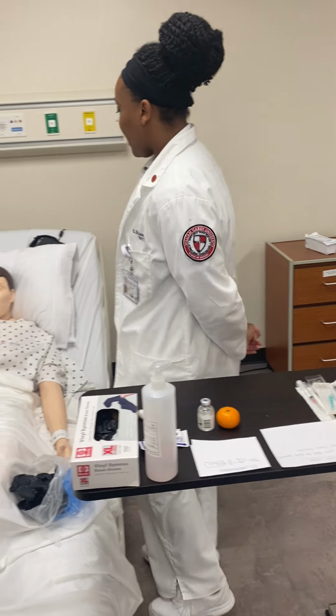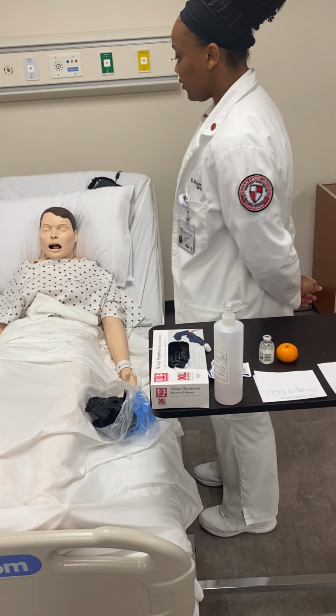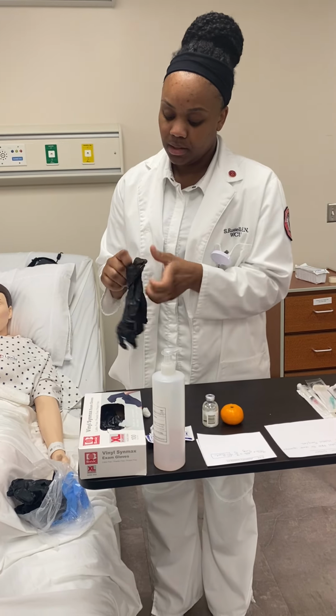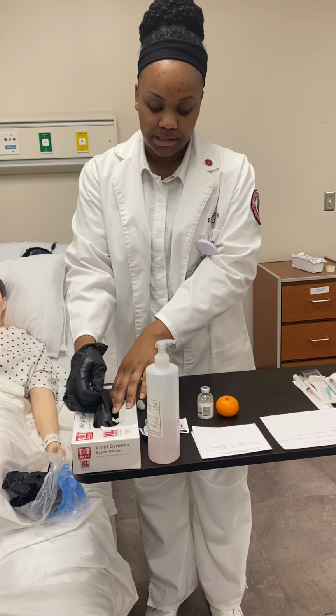So after I've done that, I'm going to identify patients. So I'll have the patient state their name and date of birth. I'll go ahead and wash my hands, don my clean gloves, and at this point, I'll go ahead and perform a focused assessment pertaining to this medication.